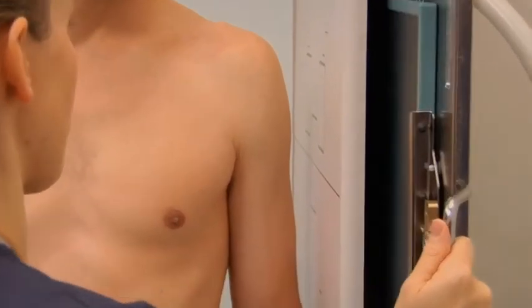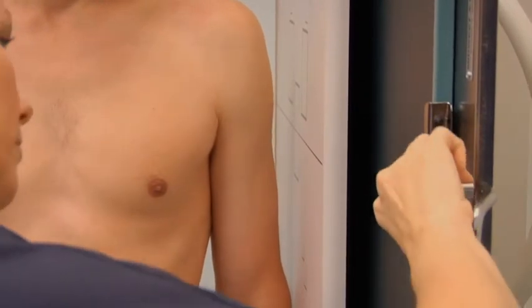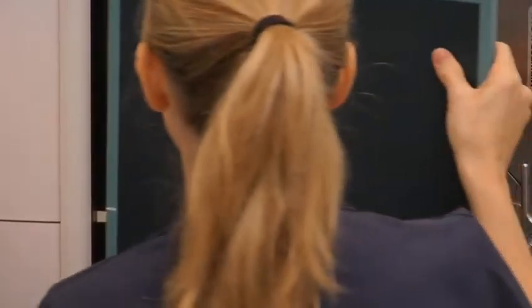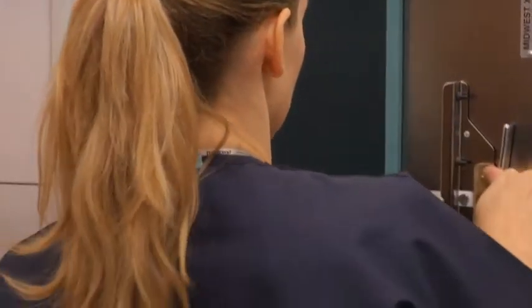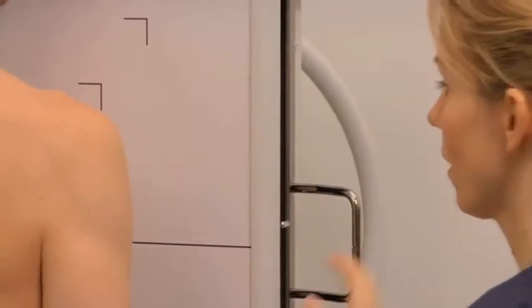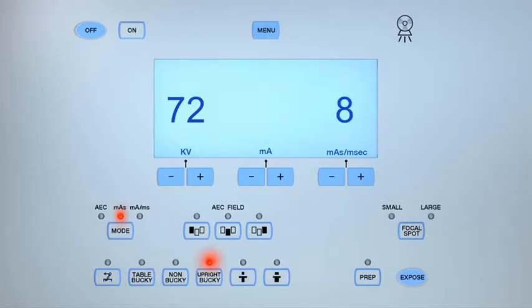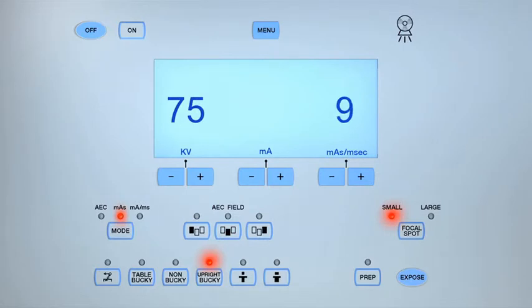Remove the cassette from the bucky and process it. For an AP oblique radiograph of the upper unilateral ribs in the left posterior oblique body position, place a 14-by-17-inch cassette lengthwise in the upright bucky. Set the exposure parameters to small focal spot, kV between 65 and 75, and MAS between 6 and 10.